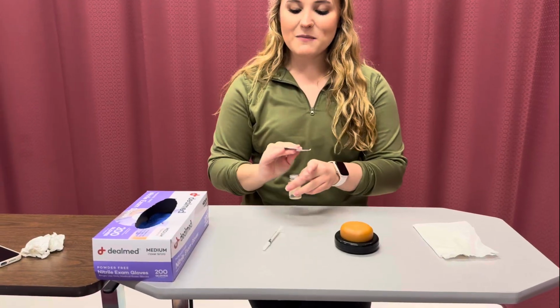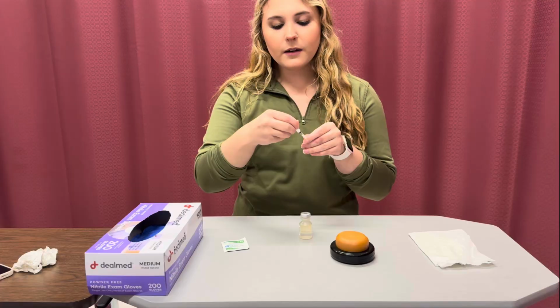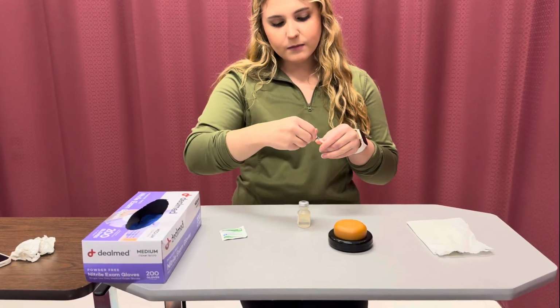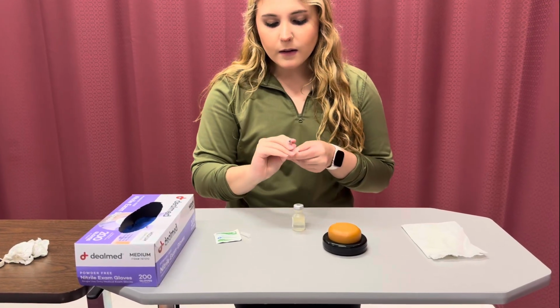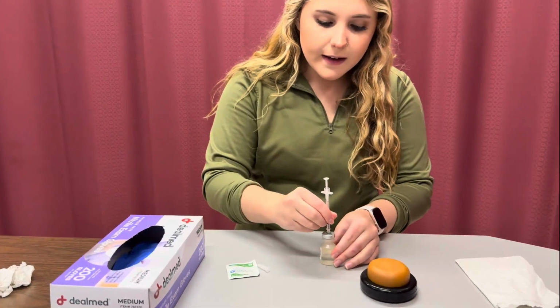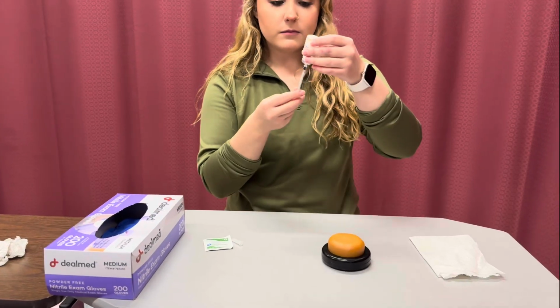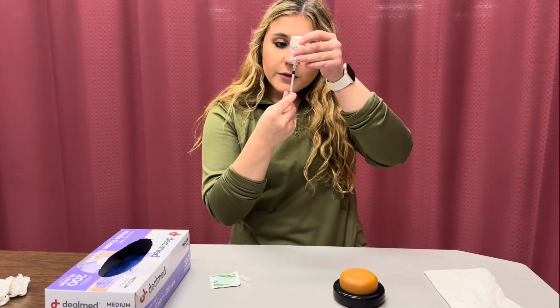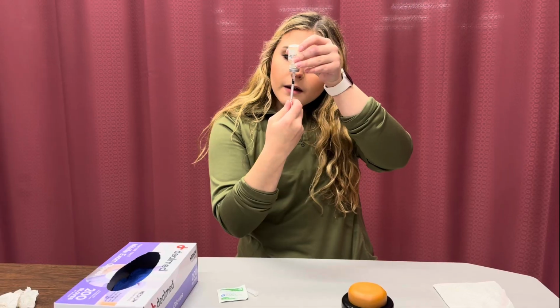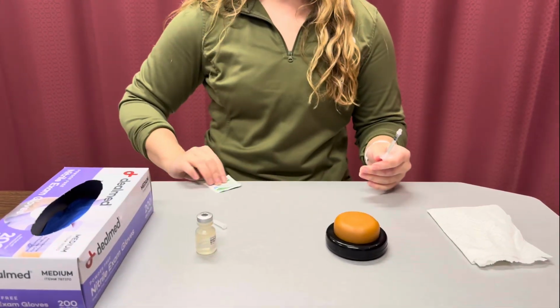I'll go ahead and clean off my vial. I'm going to get about 0.1 of the solution. Okay, I'll go ahead and pull back. Insert my air. Then retract. There we go. Okay. I would also clean off the area.